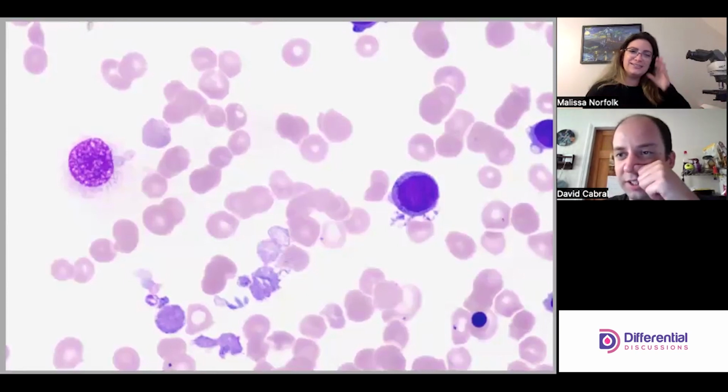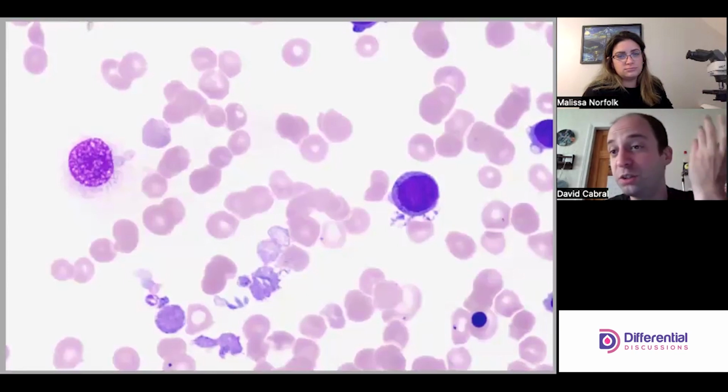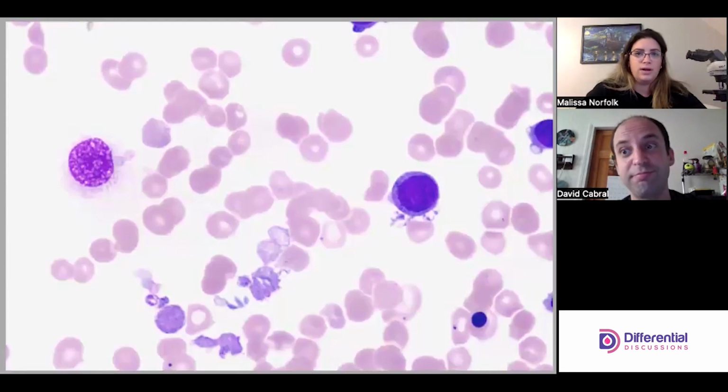So all we can kind of do is offer these little clues and hints at what's going on to help discern. But almost always you're going to be relying on cytogenetics and flow and those other things to really understand what's going on. All right, so you want to hop into it?